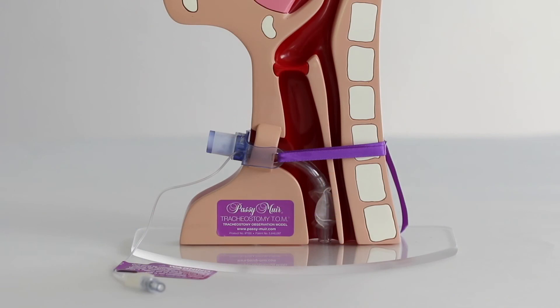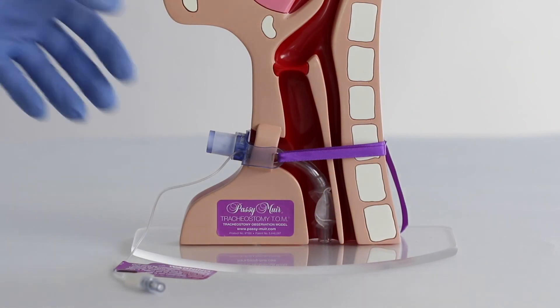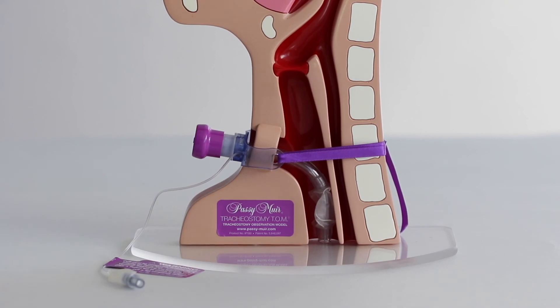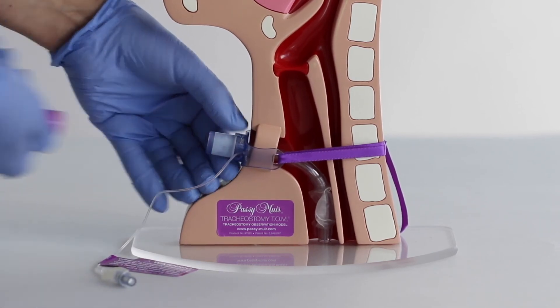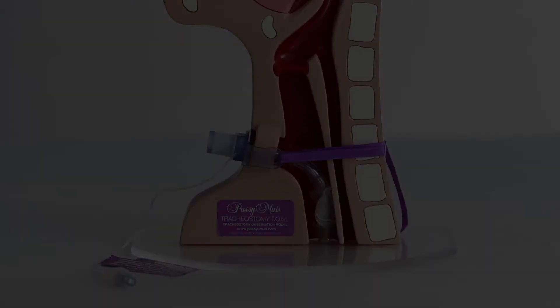Place the Passy Muir valve on the hub of the tracheostomy tube using a gentle quarter-turn twist to the right. When removing the valve, also use a quarter-turn twist to the right.